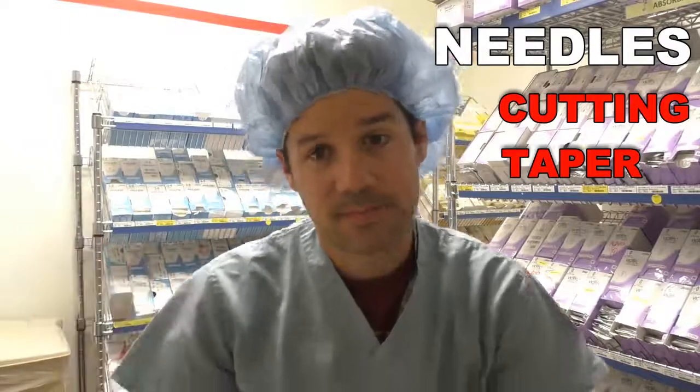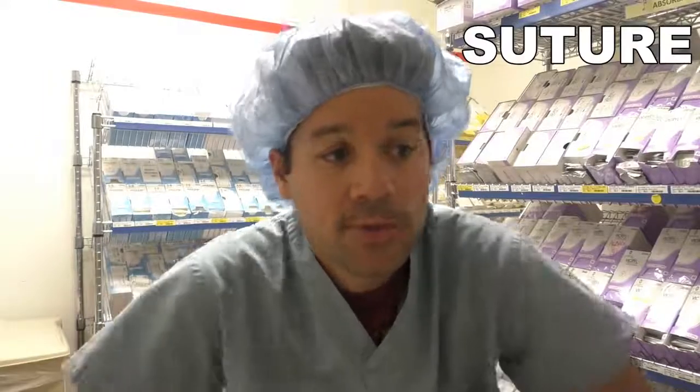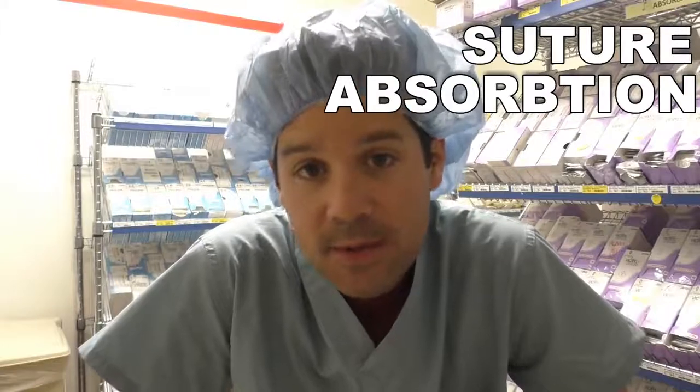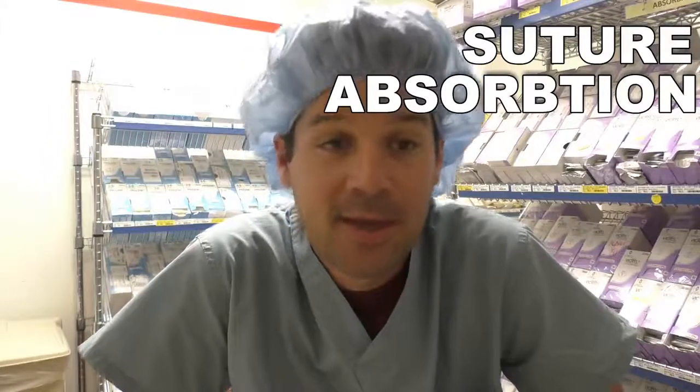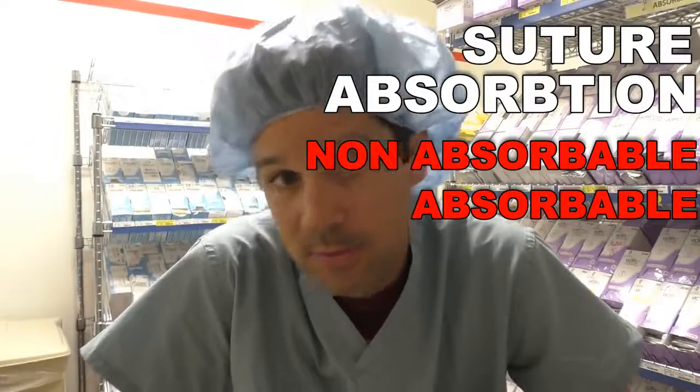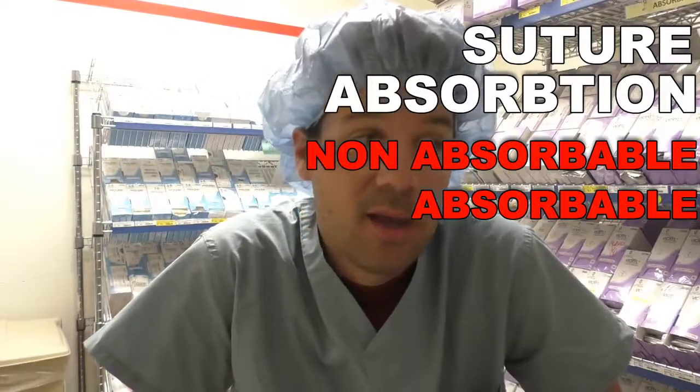Simple. Going on, let's talk about our suture, and let's talk about suture absorption. There are only two types of absorption in sutures. There's something that's non-absorbable, and there's something that's absorbable. Simple as that. It doesn't get any simpler than that. It's either absorbable or it's not. That's it. Now, when it comes to the different types of suture, that's when things get a little bit more complicated.